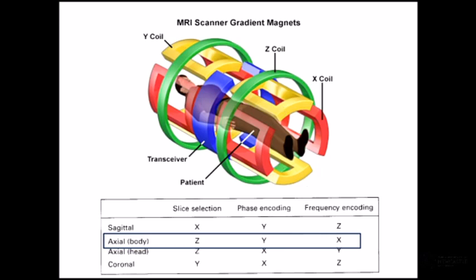And if you want to get more complicated, we can change 2 sets or even 3 sets to do true oblique imaging, which is really good. Say you're doing a shoulder scan and you want to look at the rotator cuff, which runs at an angle in the body. We do our localizer, we'll work out where our rotator cuff is, and we just swing our acquisition around and collect true coronal imaging of the rotator cuff by energising 2 sets of coils.